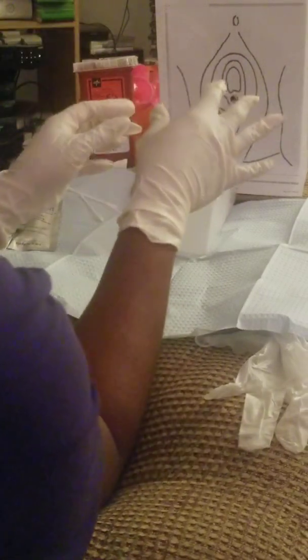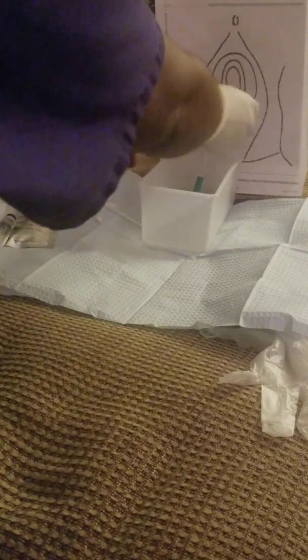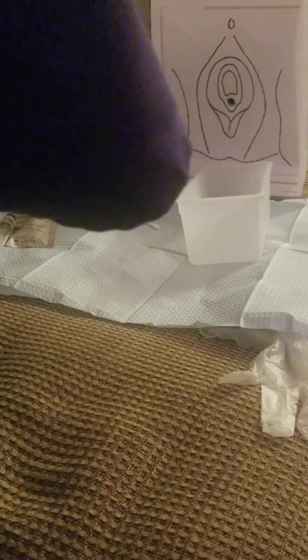So now that Miss Mary, say this is still here, now that she is done peeing, and her bladder is done emptying, I will now remove this because there's no need for me to keep it in her any longer. Ooh, hopefully that doesn't fall. And I will put this in a spot where I will be able to measure everything that happened afterwards. And I will then put this in my sharps container. Let me see if I can open it. Well, yeah, without tipping it over, but you get the gist.